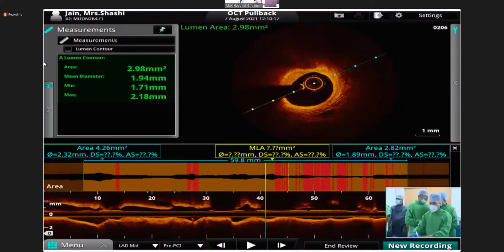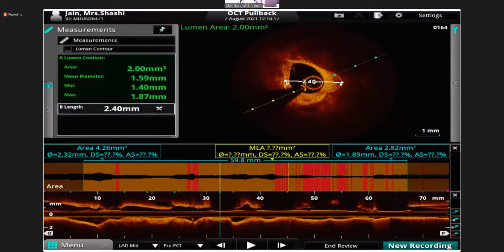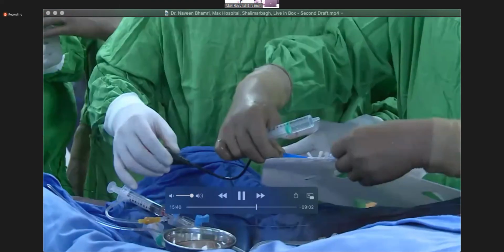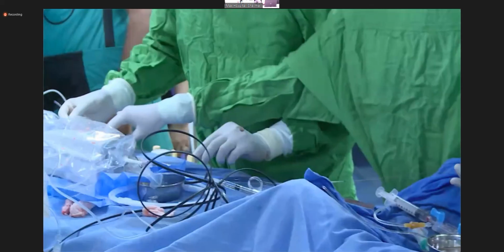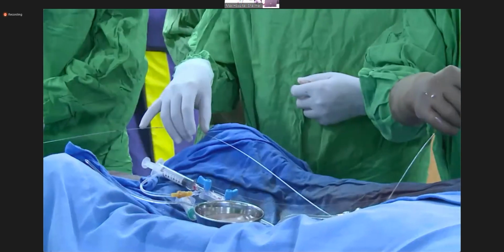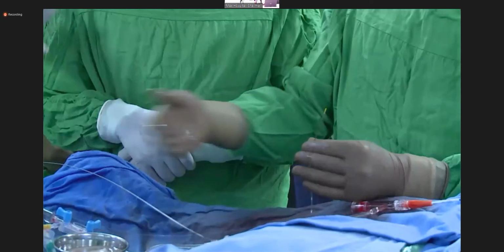So the house opinion is we should take a 3 millimeter IVL, 3 into 15? 3 into 12. 3 into 12. So we are going to use the IVL now because there is a circumferential calcium we can see. So the beauty of the IVL is we can break the intimal as well as medial calcification with this. This IVL balloon can give you a pressure up to 50 atmosphere. So that is the beauty of the IVL over rota.